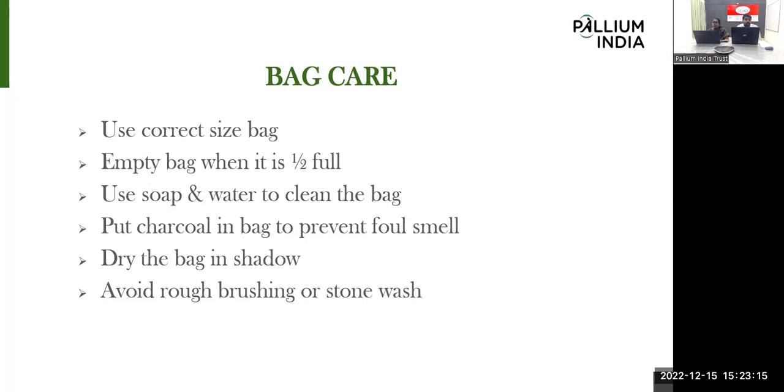Then bag care. As I already told, use the correct, appropriate size of bag only. When half to three-fourths of the bag is filled with fecal matter, they need to empty it.